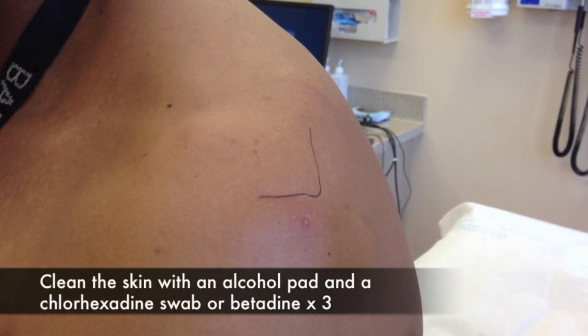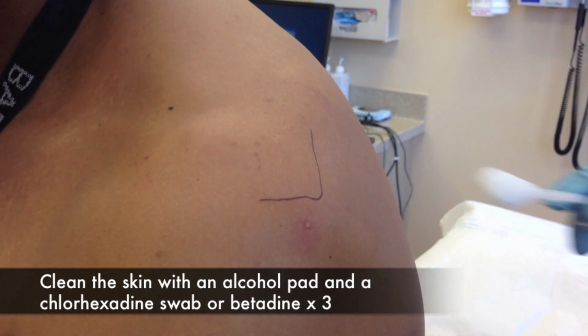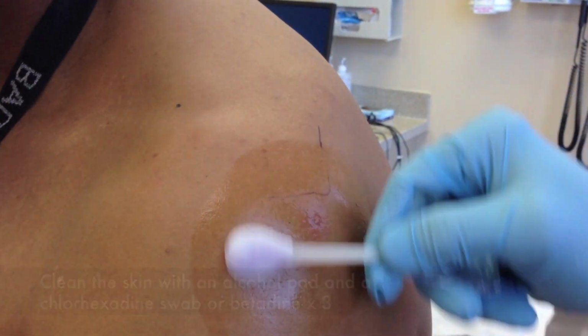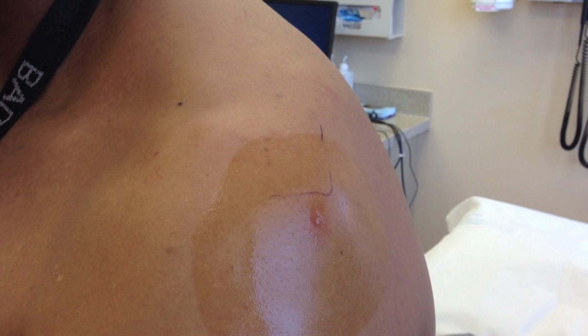Clean the skin with an alcohol pad and a chlorhexidine swab or 3 betadine swabs. You should allow the chlorhexidine or betadine to dry completely before proceeding with the procedure. This is a no-touch technique using non-sterile gloves. It is critical to identify the landmarks and site of injection prior to prepping the site.